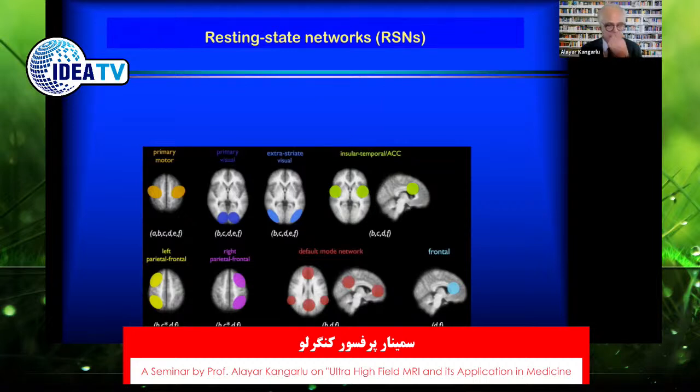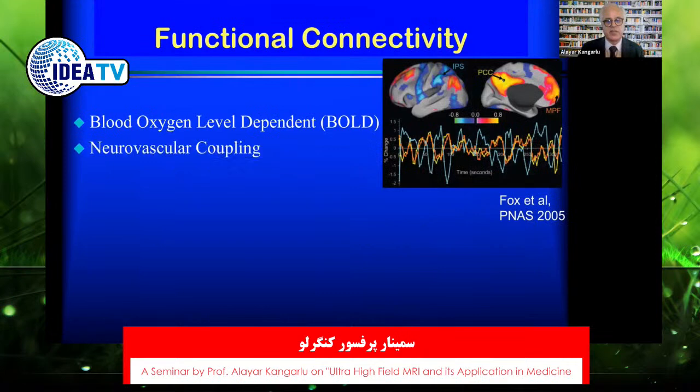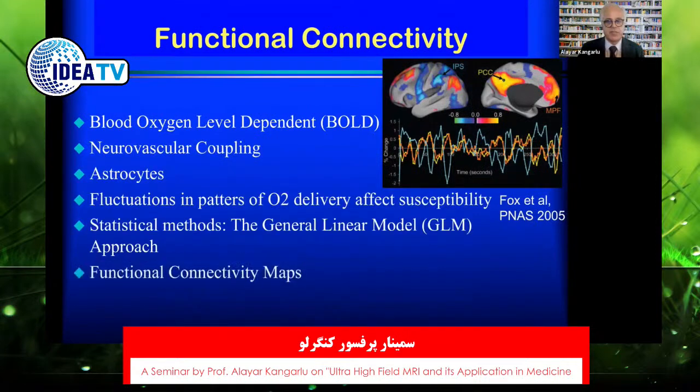And the default mode network seems to be, because you can actually monitor the temporal fluctuation of the signals during task and during rest, you would be able to see the interaction between the task networks and the default mode network, and see that the default mode network actually gets deactivated when the patient is focusing on a task at hand. And that really gave us a very good indication that, using resting state, we could establish a functional connectivity map of the brain.